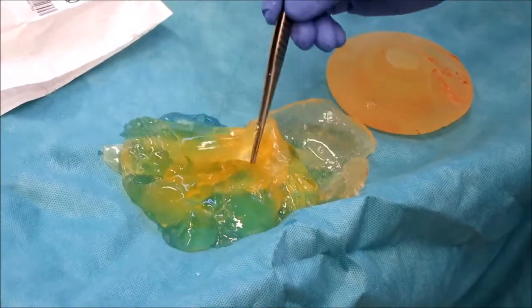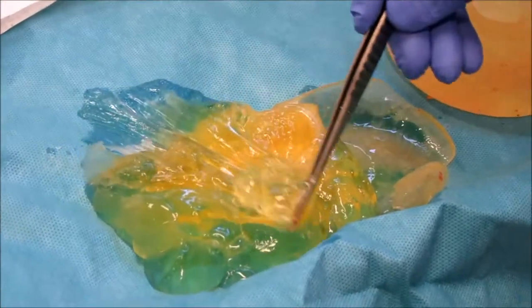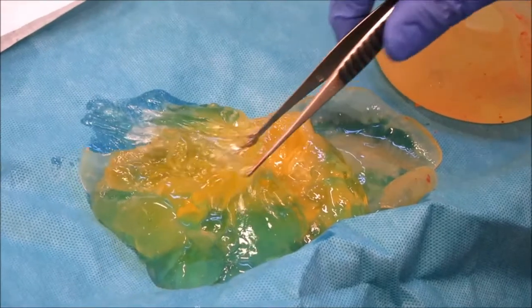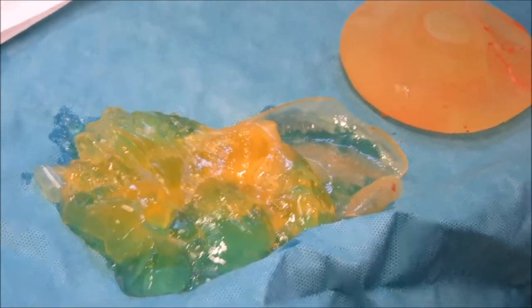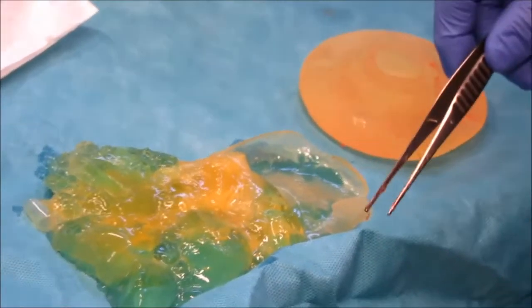But all the silicone was just lying free. You can see how it oozes onto the paper, and in the same way it was oozing into her body. Many people believe this is the reason patients can develop multiple allergies, because the silicone acts as an adjuvant and triggers autoimmune disease. So we expect she'll be a lot better following the removal of these implants.